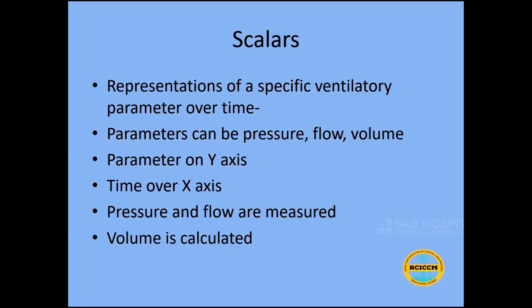A scalar is a representation of different ventilatory parameters over time. So let us look at scalars. The parameters can be pressure, flow, or volume. All these parameters are on the vertical y-axis, and time is on the x-axis.